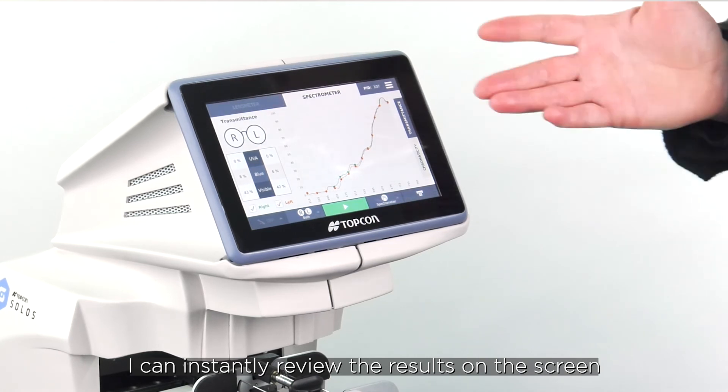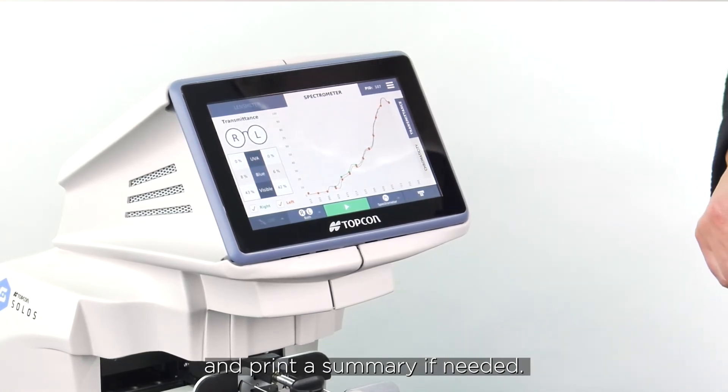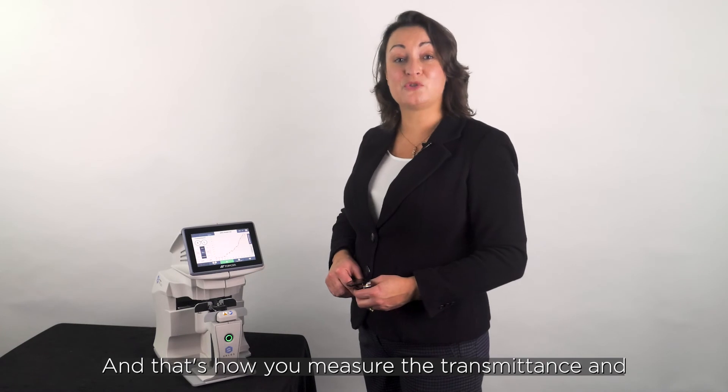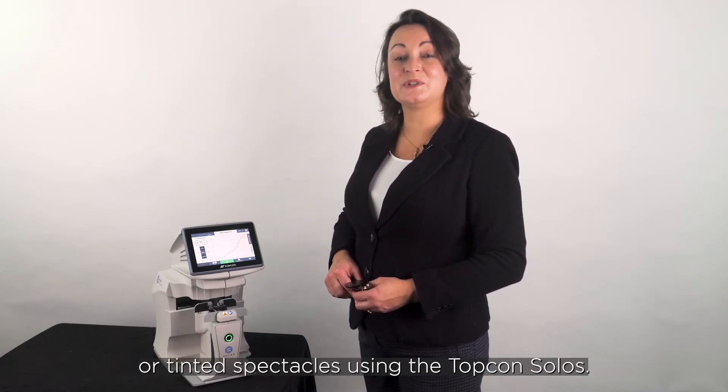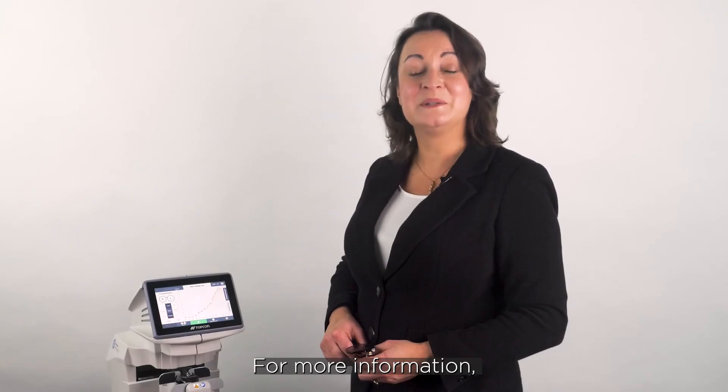I can instantly review the results on the screen and print a summary if needed. And that's how you measure the transmittance and color of a pair of sunglasses or tinted spectacles using the Topcon Solos. For more information please check out Topcon Healthcare University.